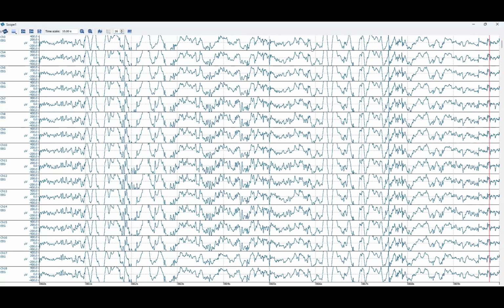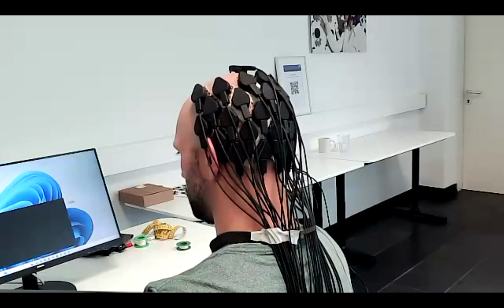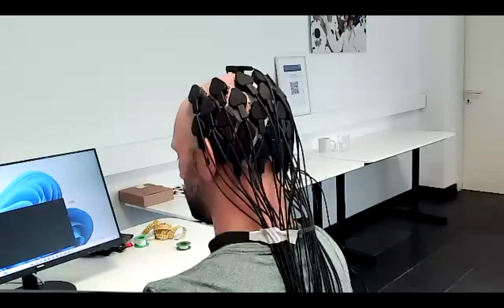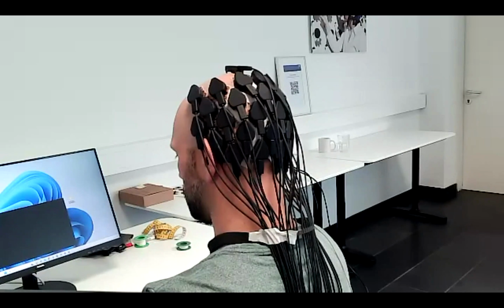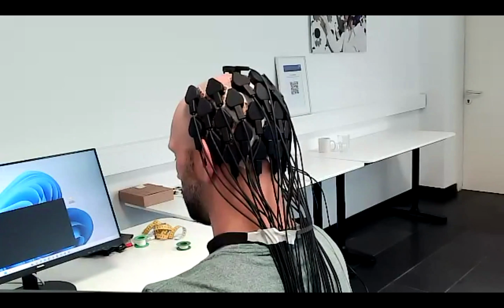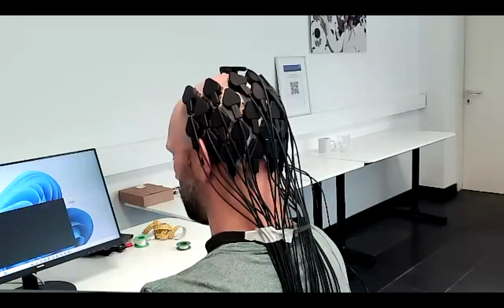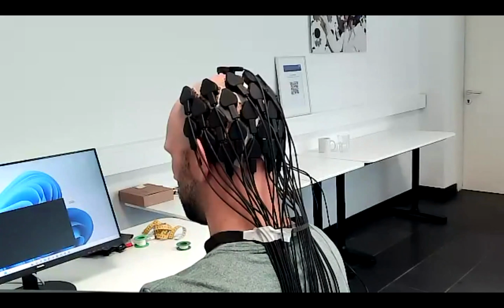Then somebody is asking, why are you using a cable to transmit the data and not Wi-Fi or Bluetooth? Yeah, well, we would like to, but this is a quite high amount of channels, and it's not so easy to transmit 512 channels with a sample rate of 1 kilohertz, for example, with Bluetooth. But this is also definitely something that is interesting, that these signals are transmitted wirelessly. Also, it's important that you then have a receiver station that can handle the income of so much data, and that is then aligned properly. And so this is quite a hard topic.